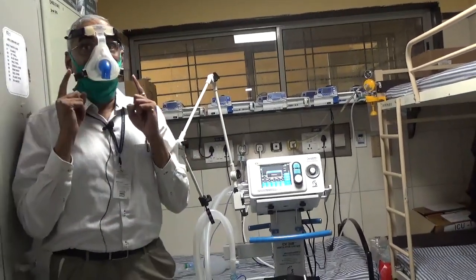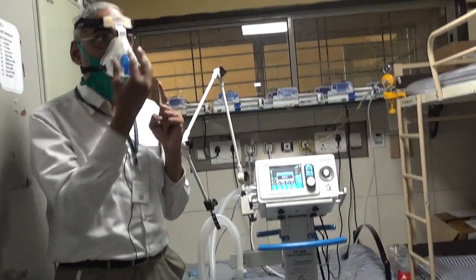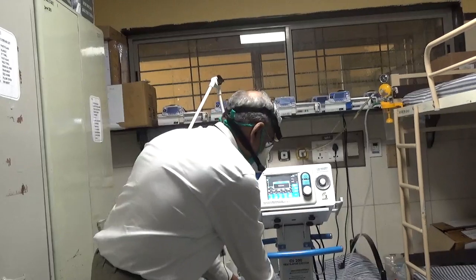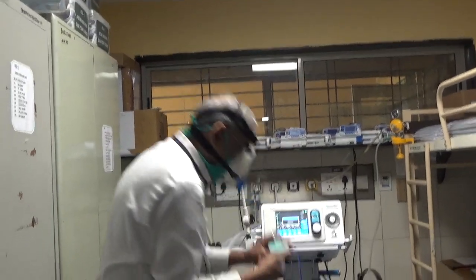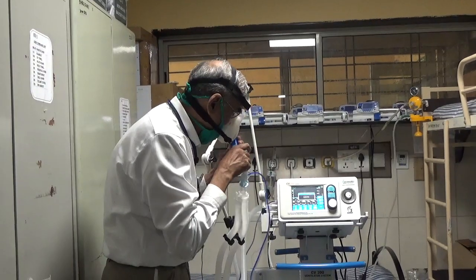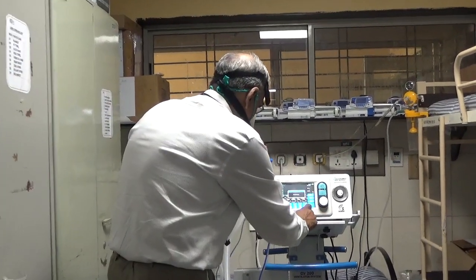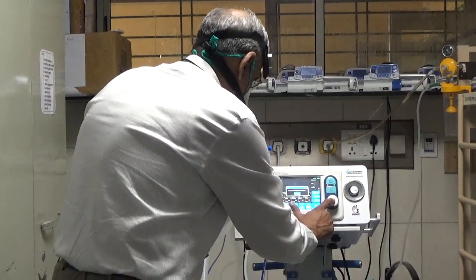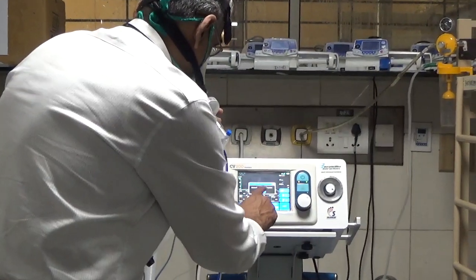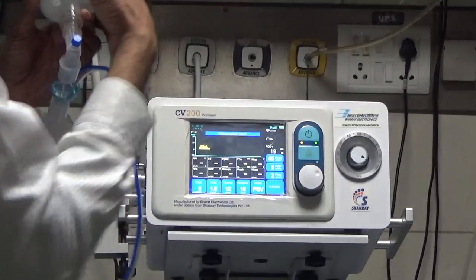Most people feel claustrophobic at this point. So you need to reassure them and hold the mask with your hand. Now you're going to see that I'm going to attach the ventilator and I'm going to So the air is coming in now.